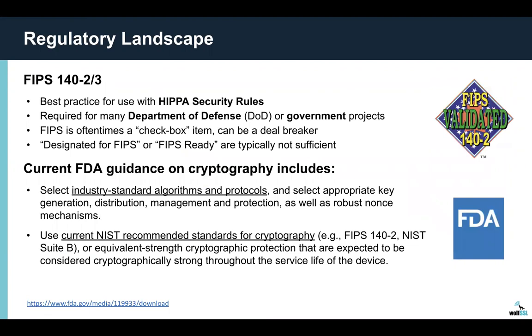So FIPS 140-2 and the upcoming FIPS 140-3, this is something that we've heard a lot from our medical customers. It's a best practice for use of the HIPAA security rules. Anything Department of Defense related or government projects often requires consuming a FIPS validated crypto library.